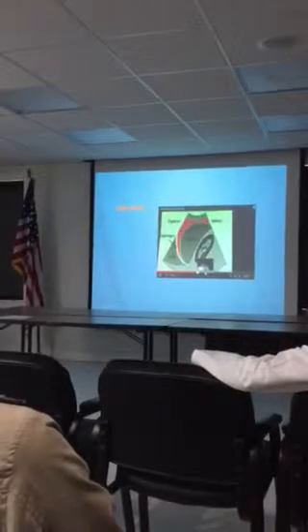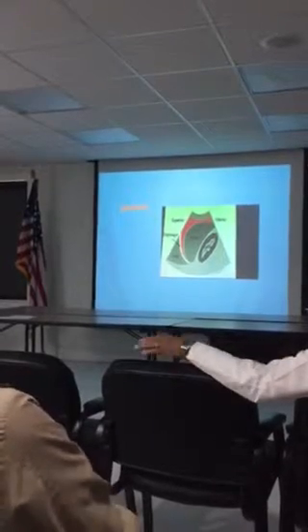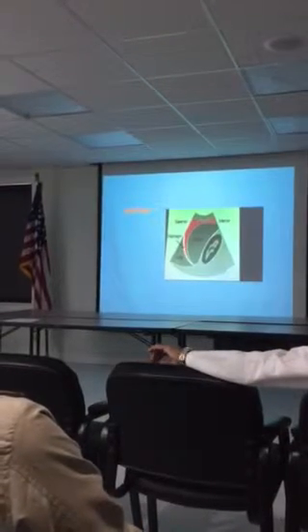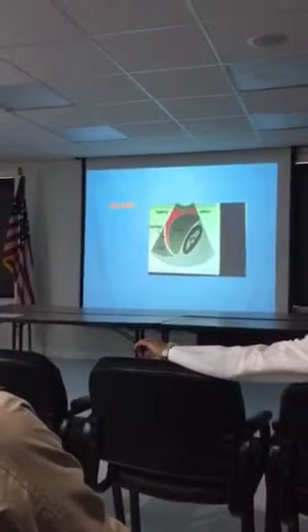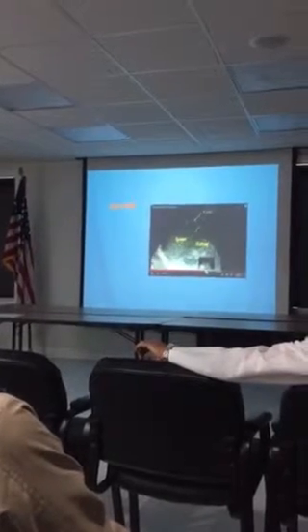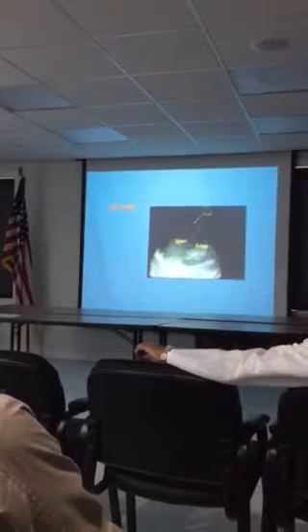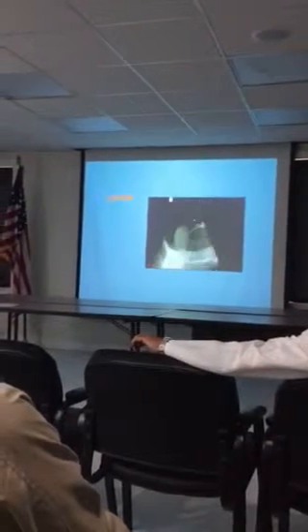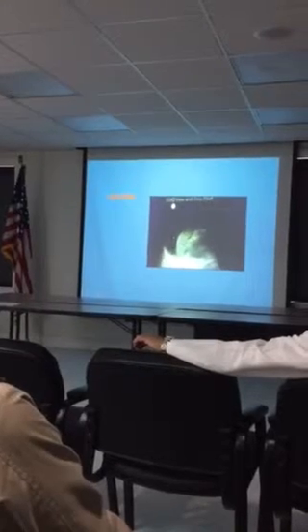See, this is the spleen here, this is the kidney here. You don't see the fluid right now, but you can see the fluid is surrounding, I mean, the spleen, okay, under the diaphragm. It looks, I mean, extensive. And see here, you see the fluid here, the stripe here, the anechoic. This is the fluid there, it's coming here between the kidney tip and the spleen tip. It's a massive one, you see? This is the anechoic fluid.